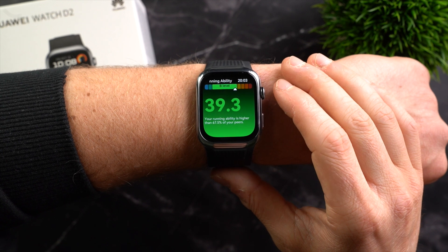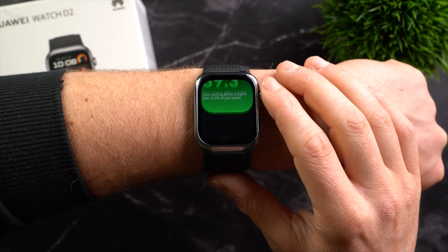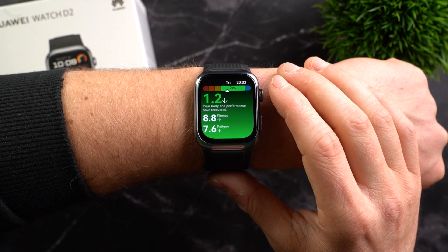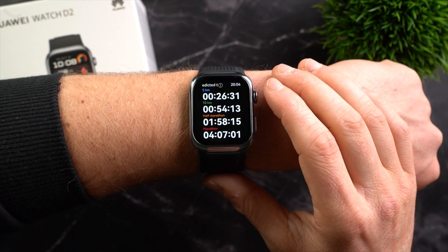Beyond training mode, there is also a widget for long-term training analysis. This shows the running ability index, allowing you to see your running performance compared to other runners, your training load, a training index, your recovery, VO2 max value, and forecasts for different running distances.